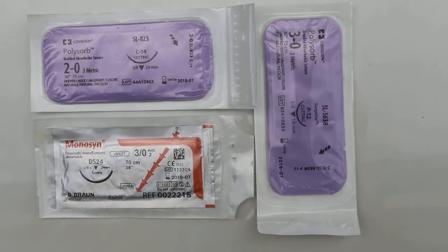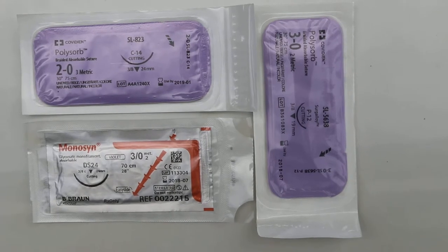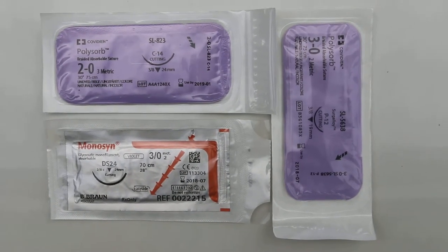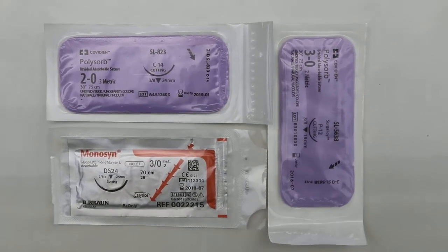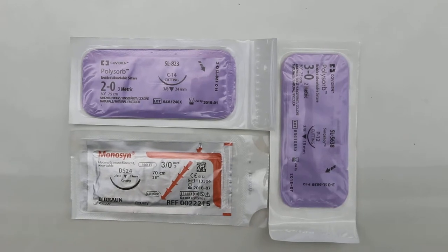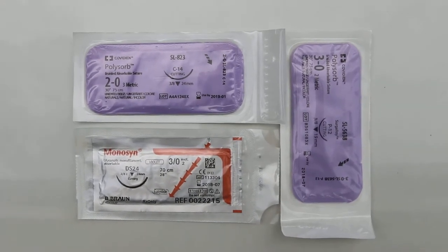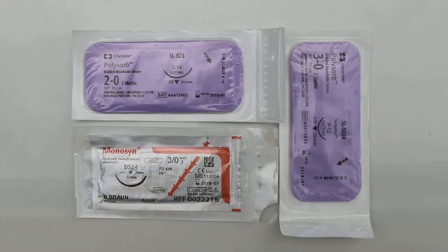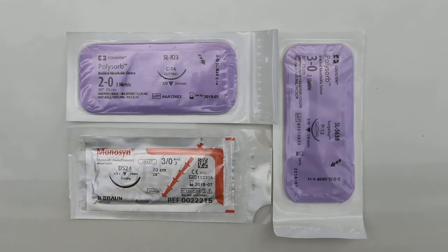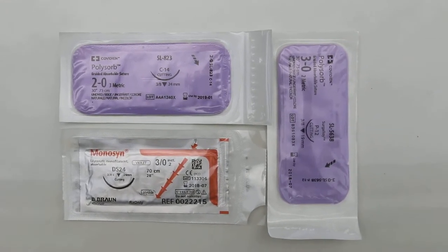As you can see, one packet of three-zero will be sufficient for a small breed like the poodle. Two-zero will be a bit too big for suturing the skin, but it can be used. In this case study, there seems to be some stitch abscess, as the sutures might be too tight.